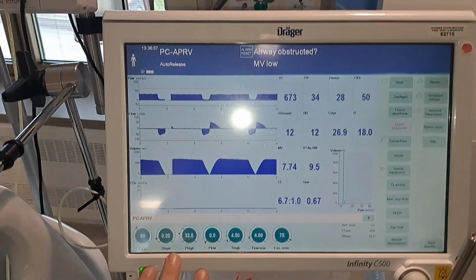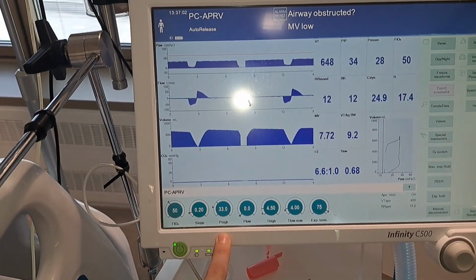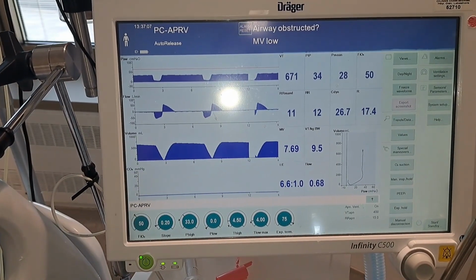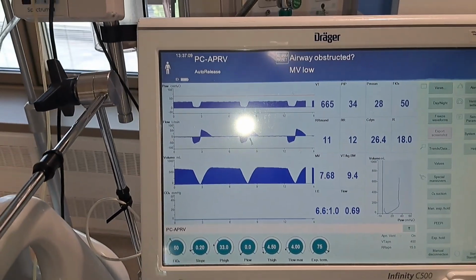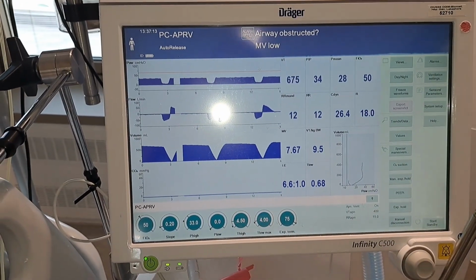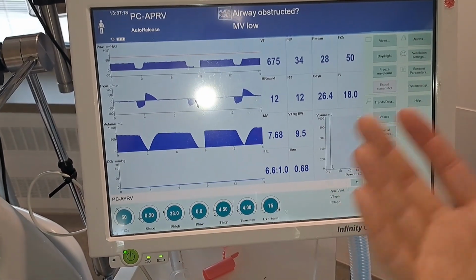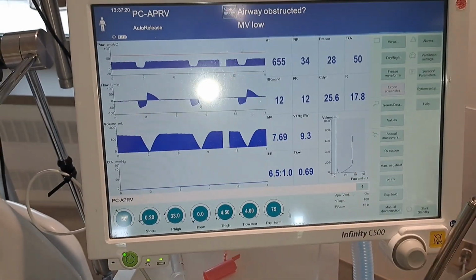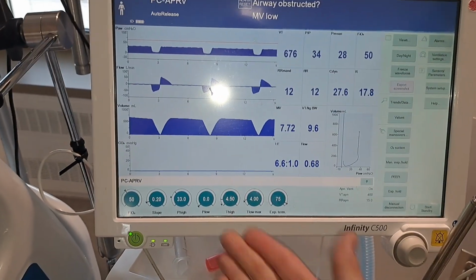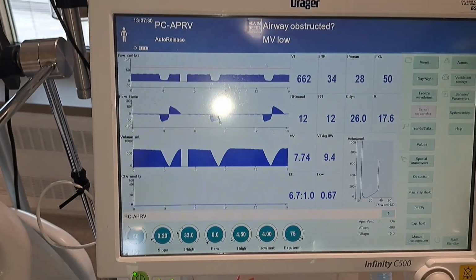So when we're looking at a conventional mode, right? In ACPC, for sure, you have your pressure control level and you have your PEEP. So in conventional ventilation, we have control over pressure. But unfortunately, we're limited, right, with time, because in ACVC, ACPC, we have an inspiratory time, 1 second often. People don't like a long inspiratory time on a control mode. So often with ACPC, we're limited to an inspiratory time of 0.8 seconds.